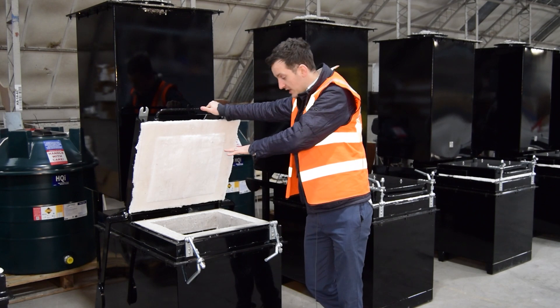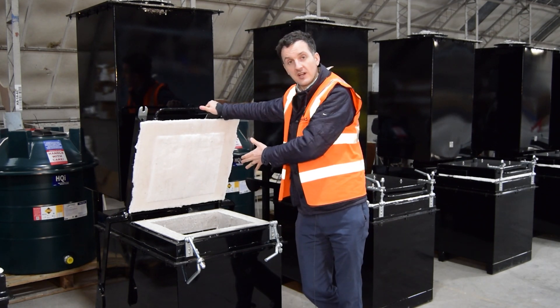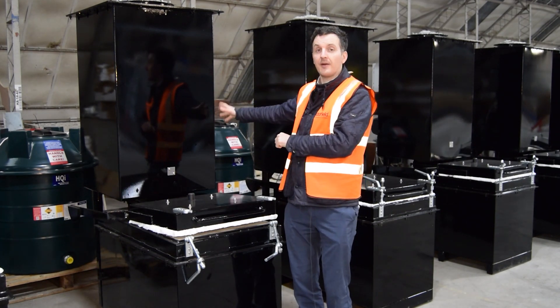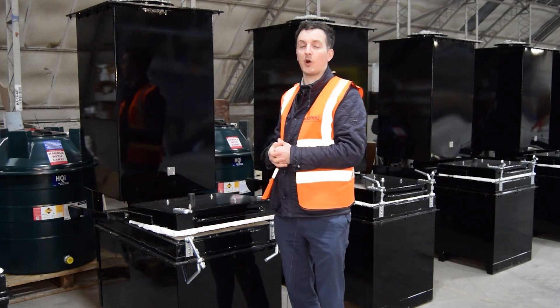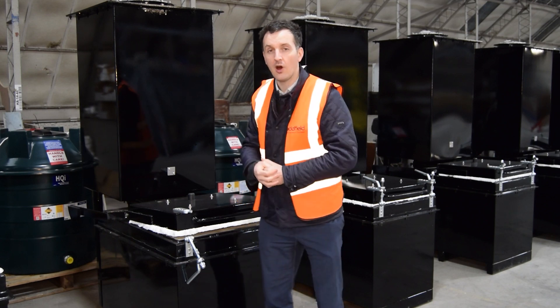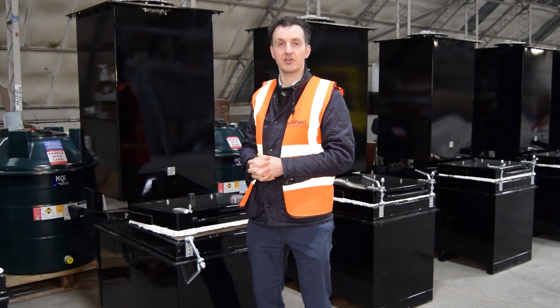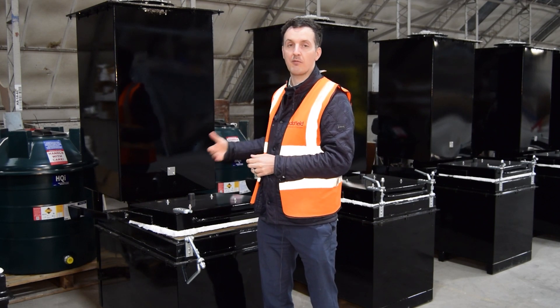On the front here you have a primary chamber. This is where the waste would actually be loaded into, and behind we have a secondary afterburner. The afterburner is designed to operate at a minimum temperature of 1100 degrees C, and it cleans the combustion gases from the primary chamber.